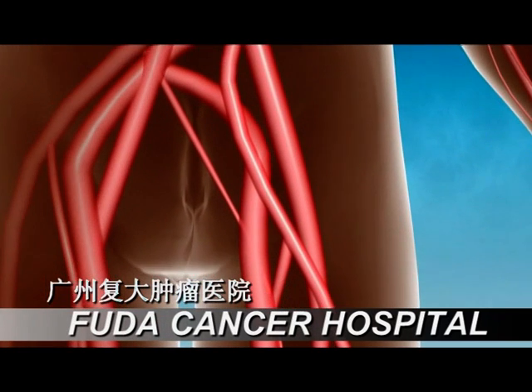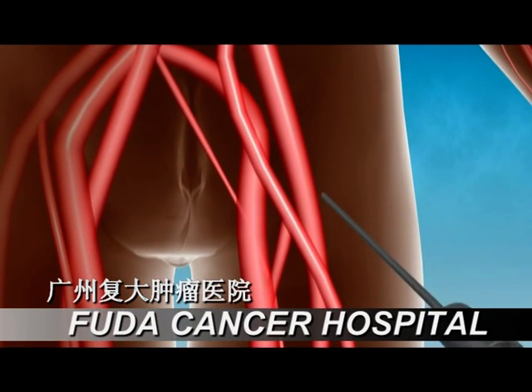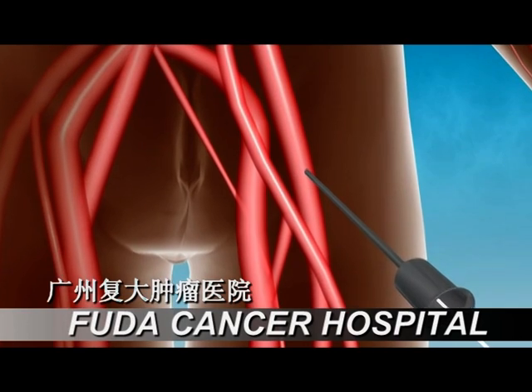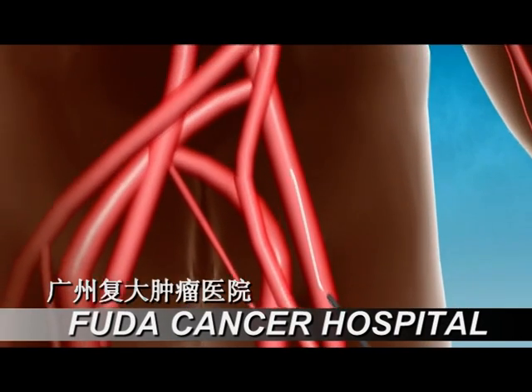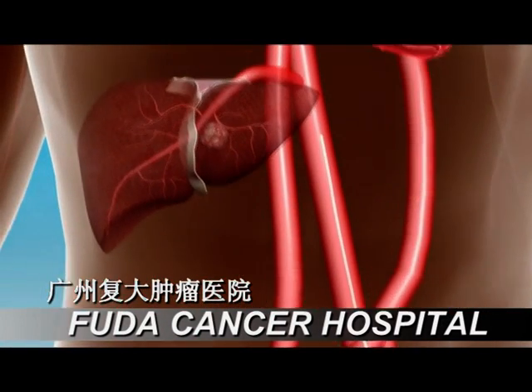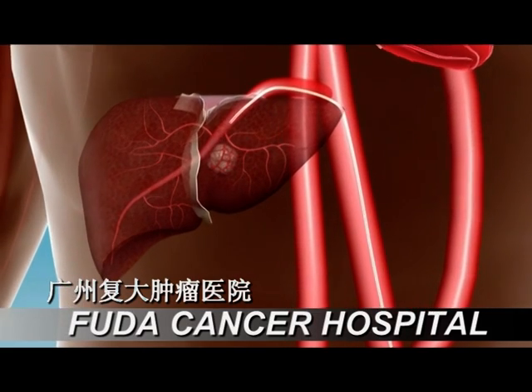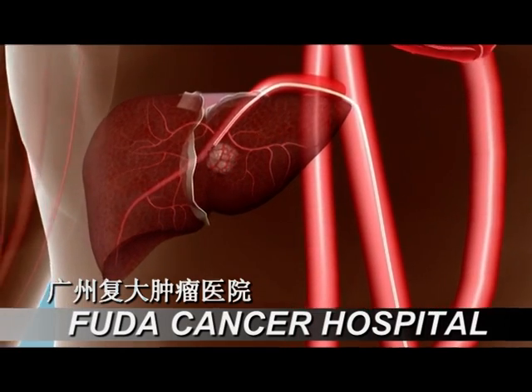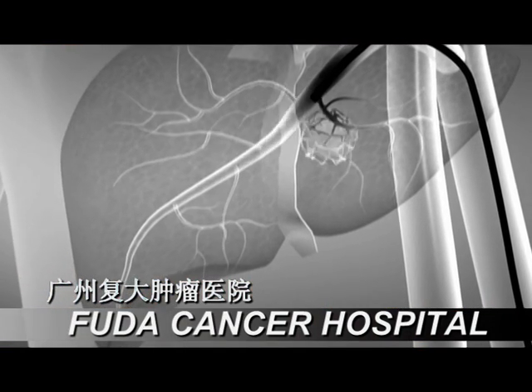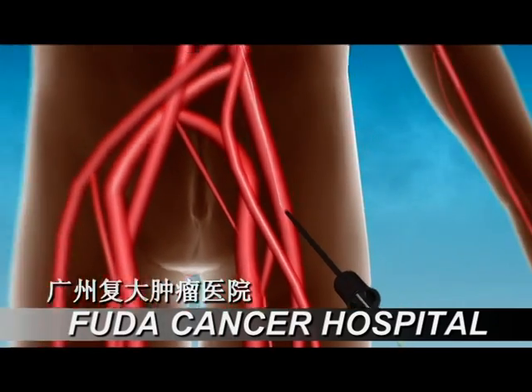With the help of femoral artery puncture, the catheter is inserted into the neighboring normal blood vessels of the tumor, and then a contrast agent is transfused into the vessels, after which the tumor size and location could be seen clearly.